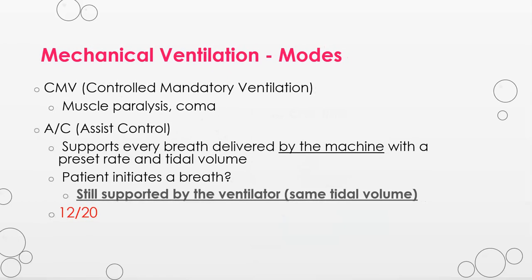Let's move on to the ventilator itself and the modes. The CMV mode, or controlled mandatory ventilation, is very rarely used. There is a set tidal volume and rate. The patient is not assisting the ventilator and more than likely is not able to breathe on their own.